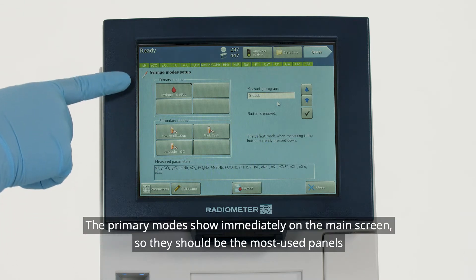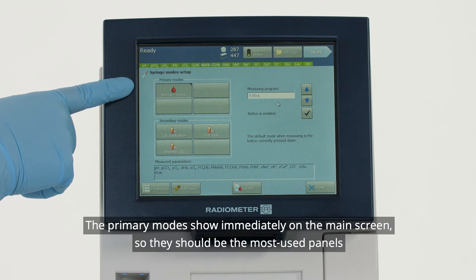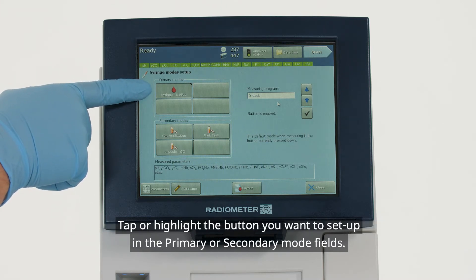The primary modes show immediately on the main screen, so they should be the most used panels. Tap or highlight the button you want to set up in the primary or secondary mode fields.